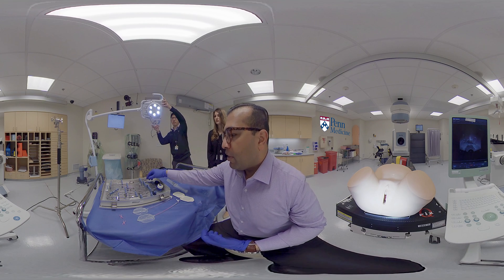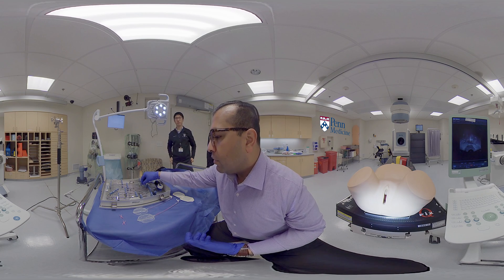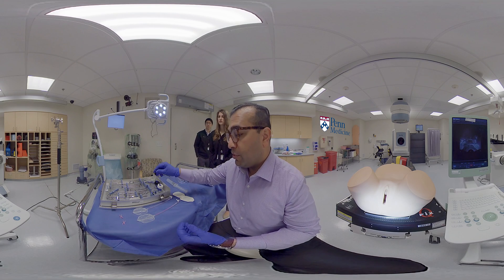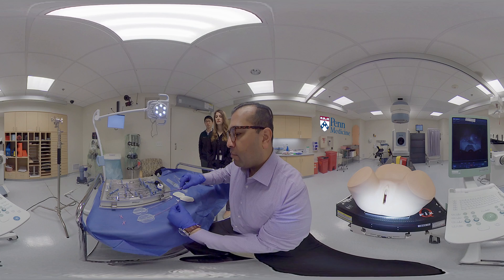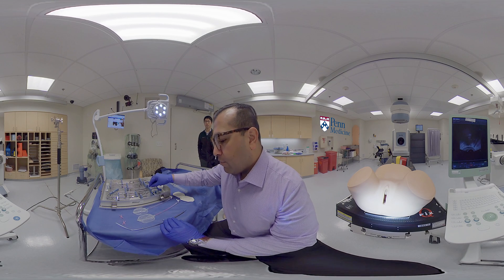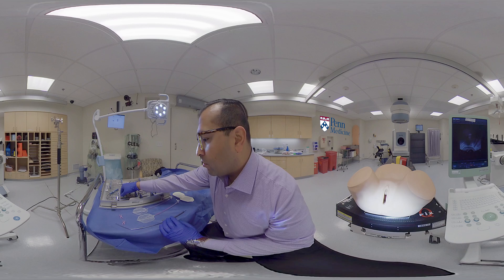To assemble the applicator, first you select which intrauterine tandem size and length you'll use. In this example, we will select a 45 degree, six centimeter intrauterine tandem. You can see it has this notch over here, as well as a post for which the ring will slide over and then screw onto. If you're selecting a 45 degree angle tandem, you use a matching 45 degree angle ring.